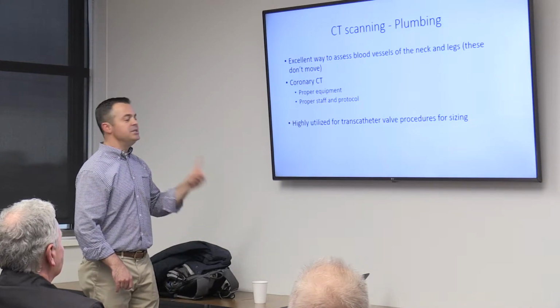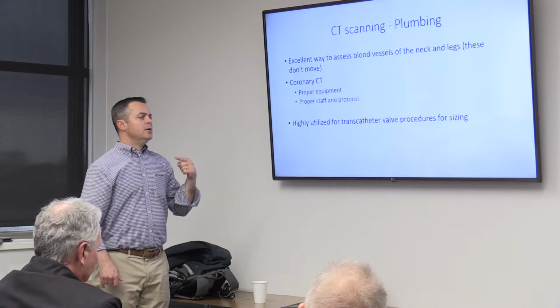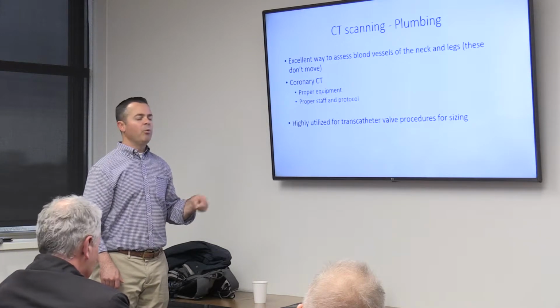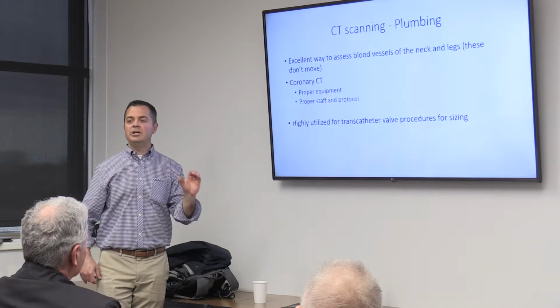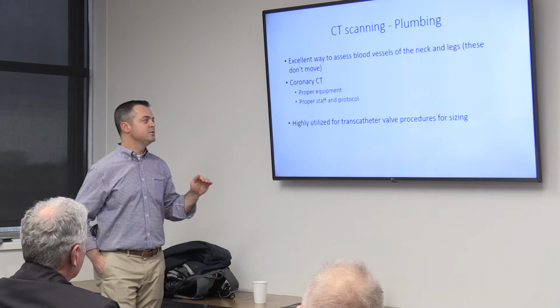Anyway, CT scanner. And like I said, I think ours may be the fastest in the state. It is, I think, one of two around here that's 256 slice. So I mean, the radiation dose is substantially less than what people use.